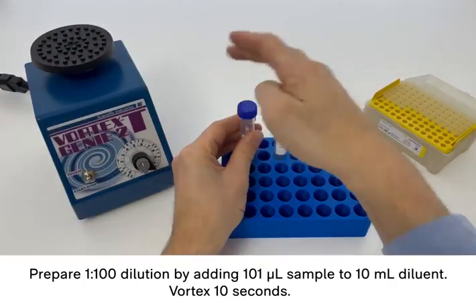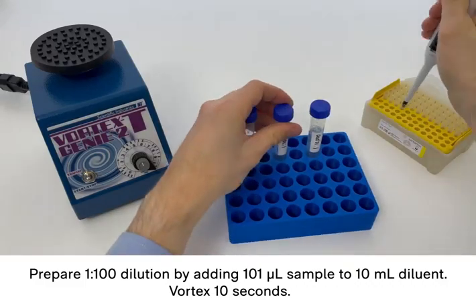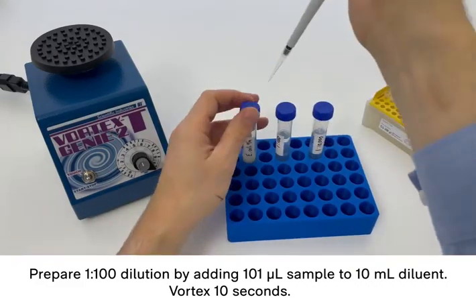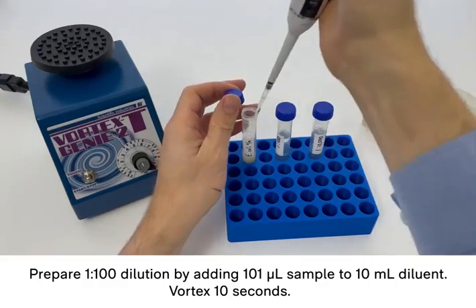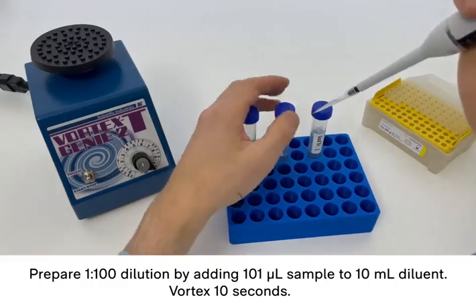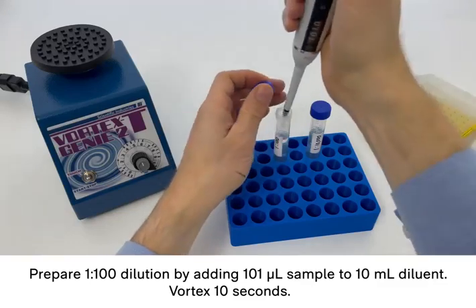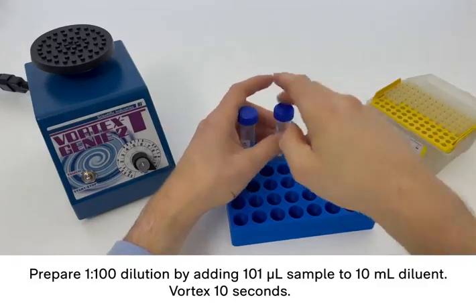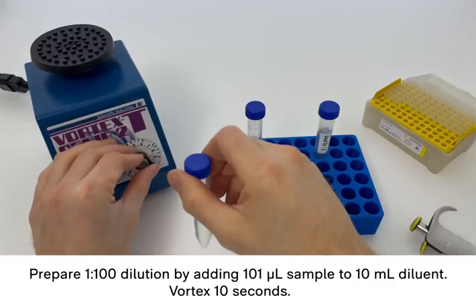After the sample has been homogenized, I make the 1 to 100 dilution by adding 101 microliter to the 10 mL of diluent in the tube. Here we go. And then I vortex again, this time for 10 seconds.